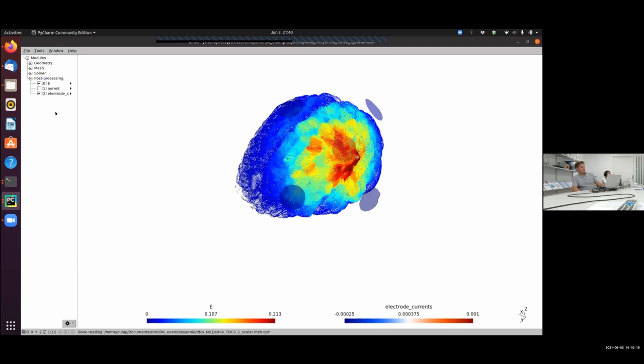But de facto, you might want to consider electrode montages which have a larger coverage also at the back of the head, also further down. So when this is of interest to you, we can point you to where to add additional electrodes to a file, and then run the head models again to get further coverage further down. Otherwise, it doesn't really differ from optimization for normal brain stimulation of the cerebrum. Only the way you pass on the coordinate is slightly different.